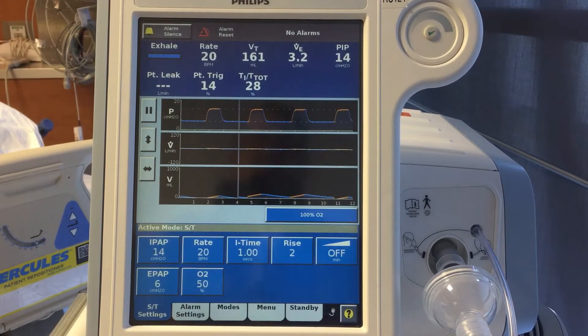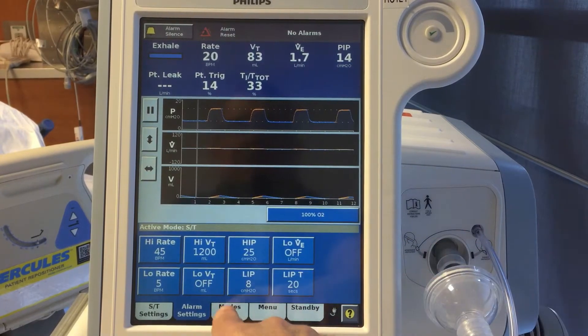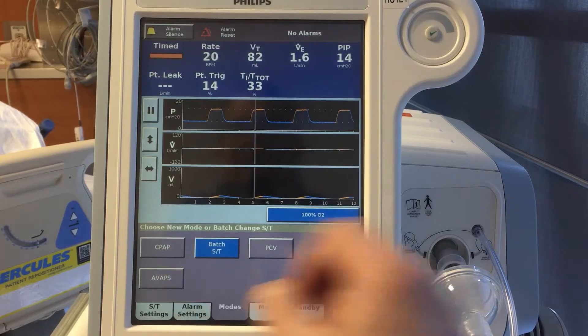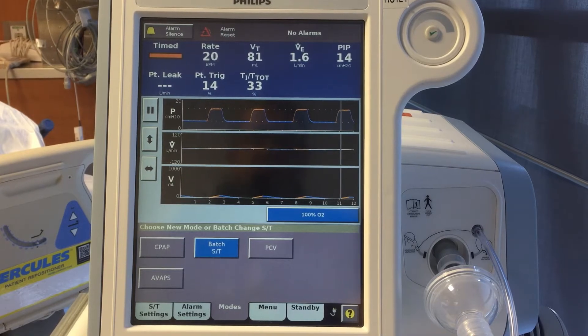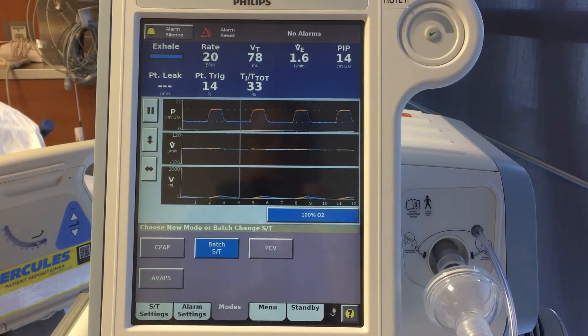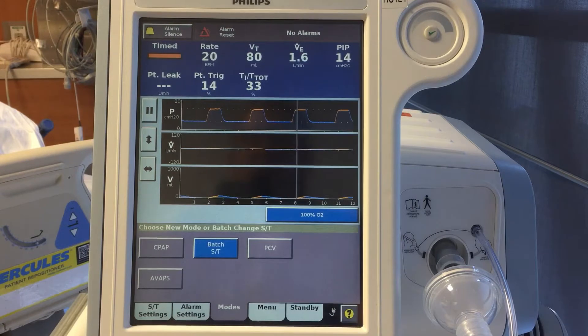Before we apply it to the patient's face we need to put our settings in. There are a few different modes on this particular machine: pressure control, CPAP, and AVAPs. We're not going to cover all of those right now — AVAPs and pressure control are covered in another video on my YouTube channel. But let's talk about the difference between CPAP and ST modes.